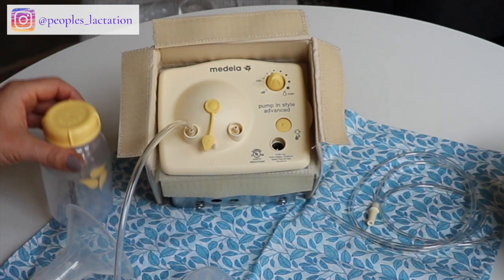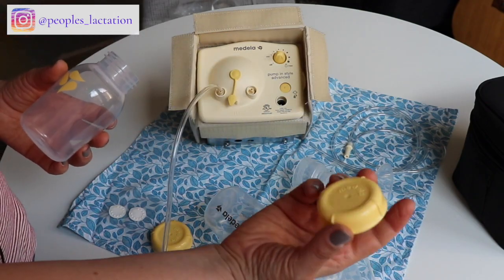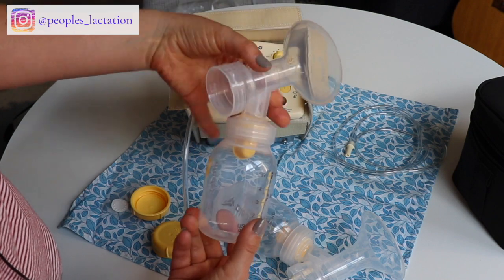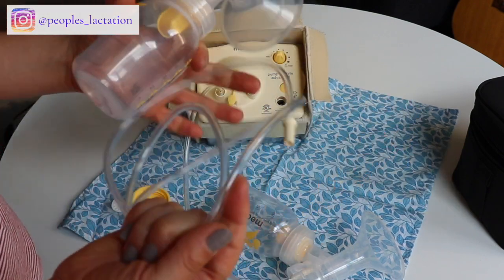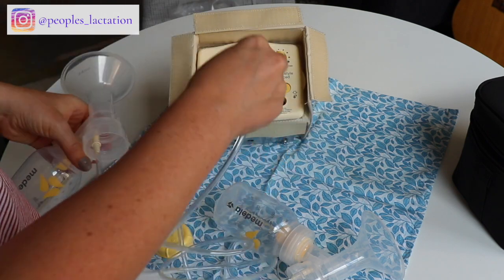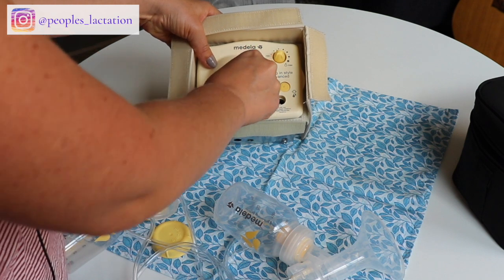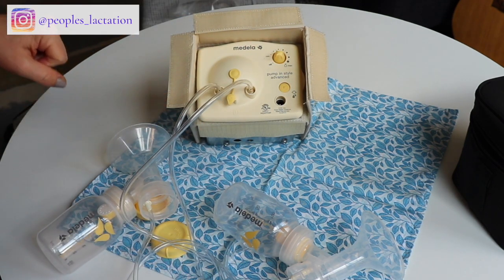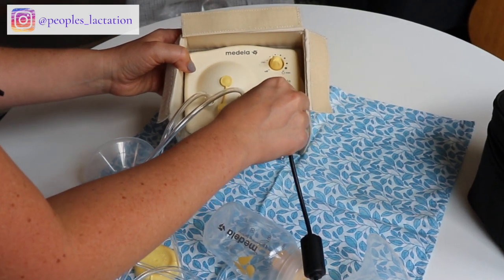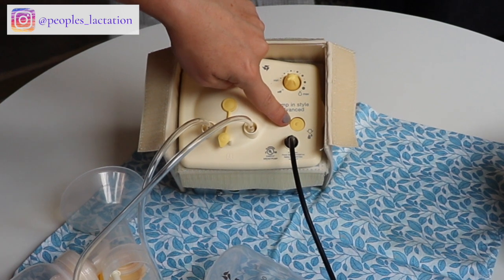I'm going to go ahead and set up the dual-sided pumping. The kits do come with some little caps for your bottles. Hard plastic piece goes into the hole in the back, and we connect the tube for dual-sided pumping. Let me plug this in and walk you through the functionality — the power adapter goes right here in this hole on the front.